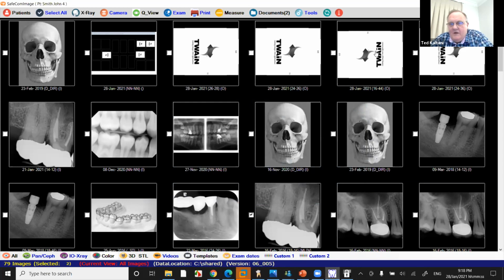It will send it through our secure server, encrypted, then it will only decrypt on the receiver side. So it uses end-to-end encryption, so there is no middleman attack, and even though we own the servers, we can't view the messages because they're encrypted at source. So end-to-end encryption is for privacy reasons and to make it easy to send large files from one spot to another.